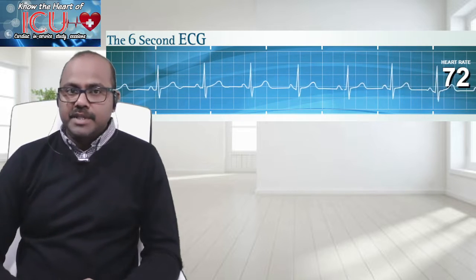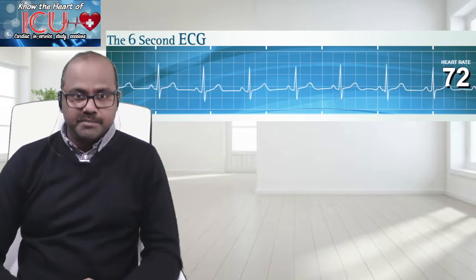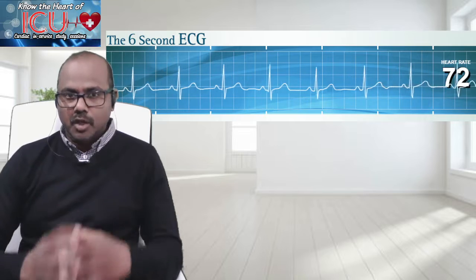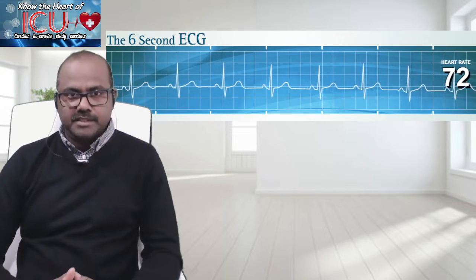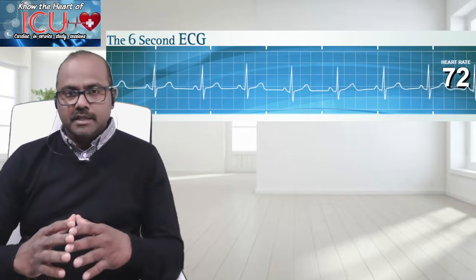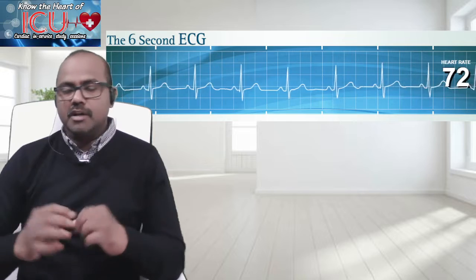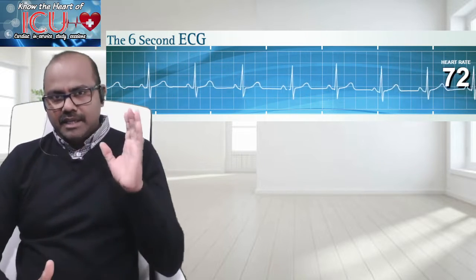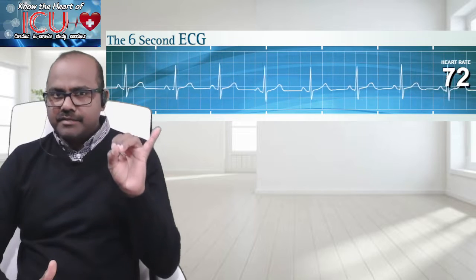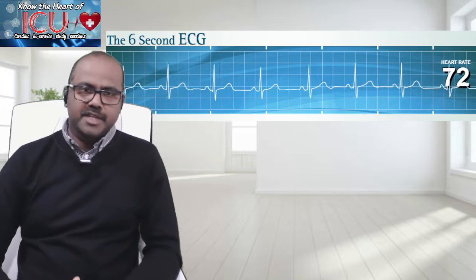So far we have completed Unit 1 and 2 chapters in Unit 1. In Chapter 1, you have seen normal ECGs, and in Chapter 2, you had seen all the dysarrhythmias. And now you know that the dysarrhythmias can be categorized based on the origin of the impulse. If the impulse originates from the SA node, it's sinus dysarrhythmias. You can have sinus brady, sinus tachy, and sinus arrhythmia on top of the normal sinus rhythm.